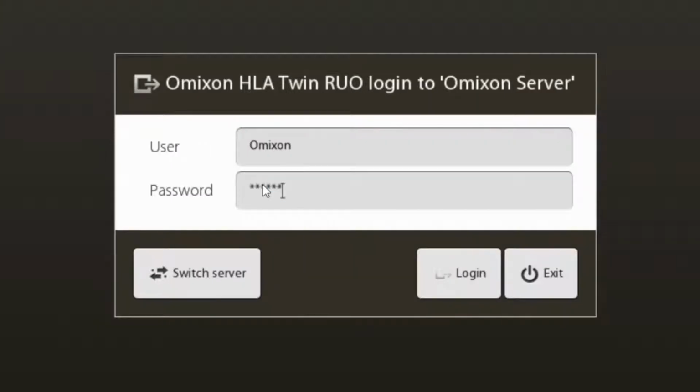Each user has his own private login credentials. There are two levels of users. One, the super user, who has all permissions to change the software settings or manage other users' profiles. And two, the analyst, who has more restricted permissions used by lab technicians, for example.